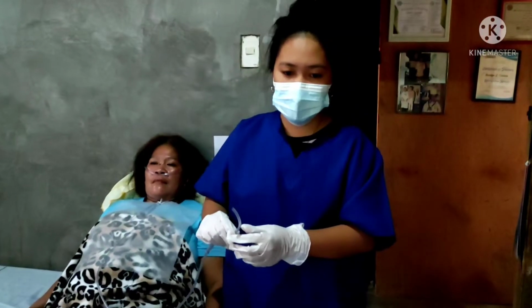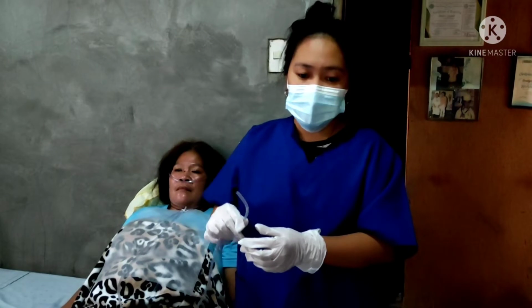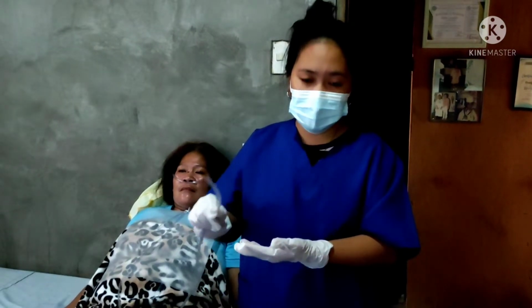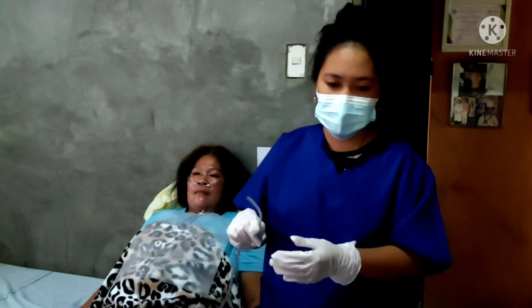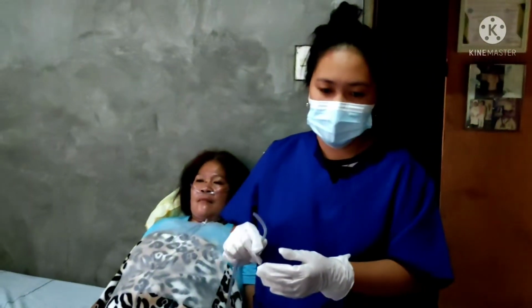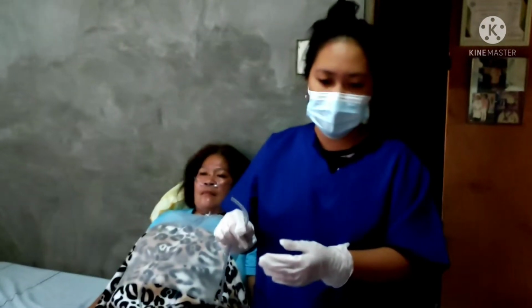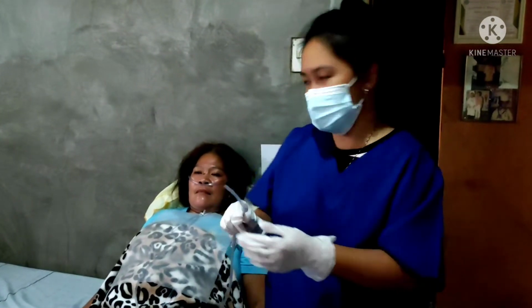If the patient has an oxygen mask, remove it or keep it near her place. If she has a nasal cannula, leave it in place. Now insert the catheter into the patient's mouth, moving along the gum line toward the pharynx.